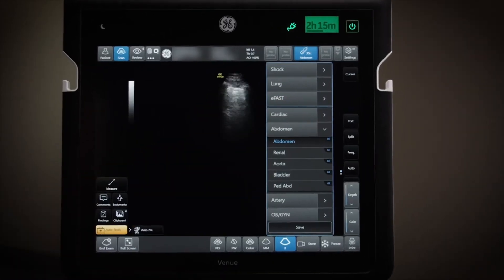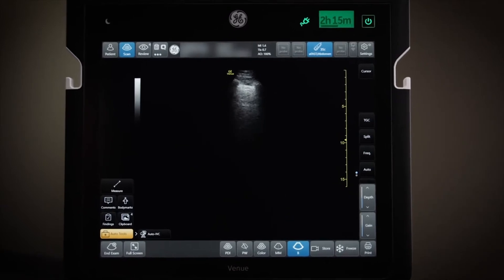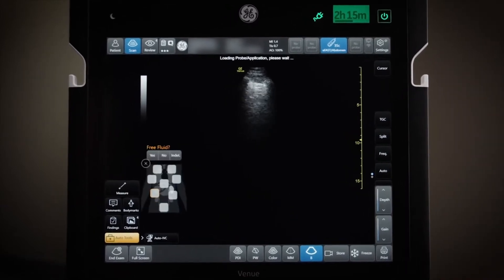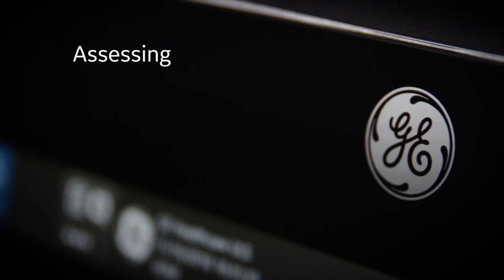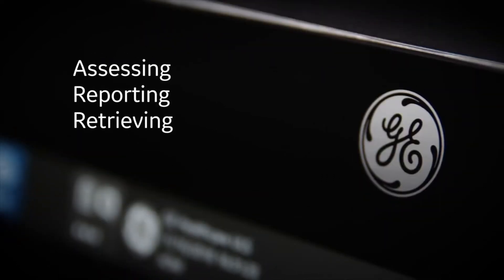Everything changes with GE Healthcare's eFAST navigation tool. Assessing, reporting, and retrieving is now as easy as 1-2-3.